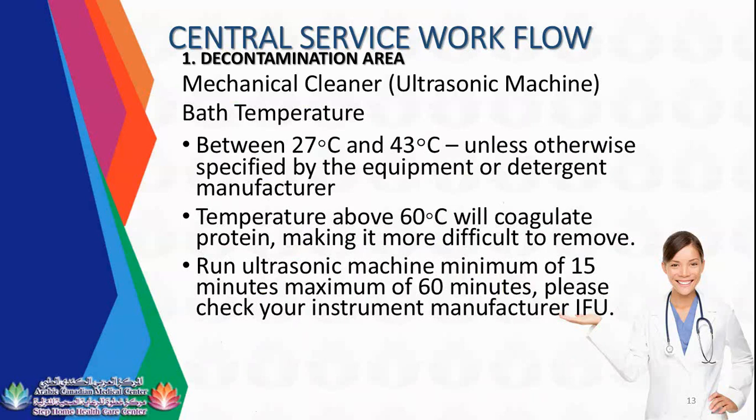can easily dislodge soiled instruments, especially if there is dried blood in your instruments. It can easily be removed using a temperature bath of 27 degrees Celsius to 43 degrees Celsius. So, a temperature above 60 degrees is not allowed. It is not recommended because it will coagulate protein.